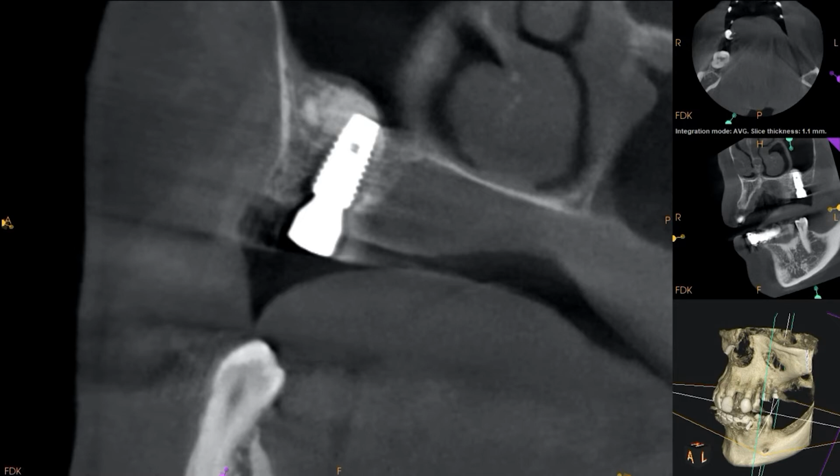There is bone all the way around the implant, which is great. We lifted it a good 6-7 millimeters, which is fantastic. I'm happy with how it looks. I think you know, for full style points, I call it, it'd be nice if that graft went all the way over to the medial wall. But I'm really happy with what we've done. The implant's probably in about 50 to 60% native bone, and then maybe 40-50% in our graft material. So I like what I see there from a graft standpoint.